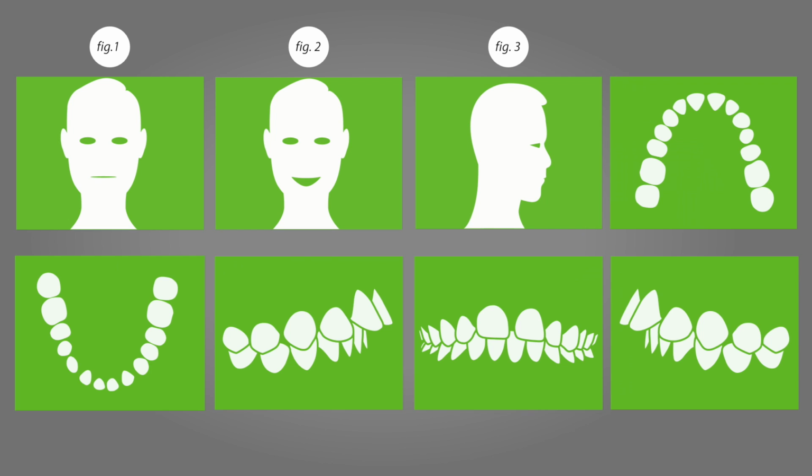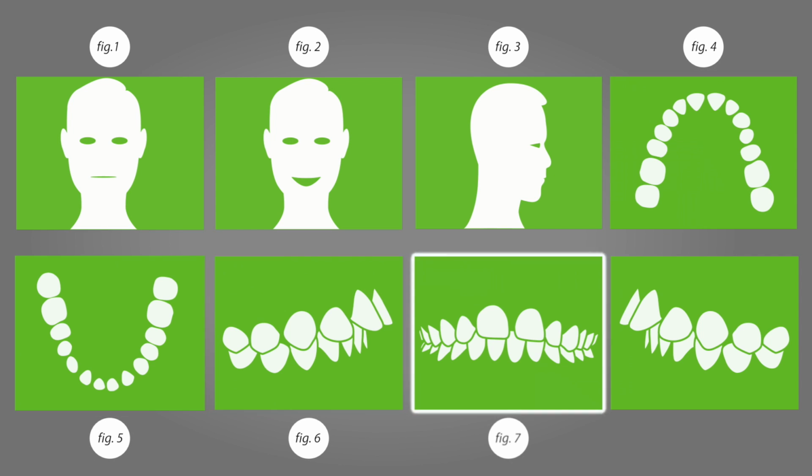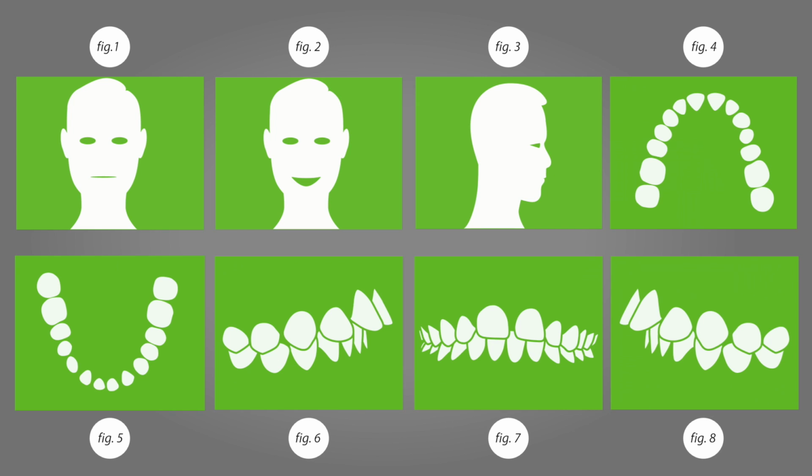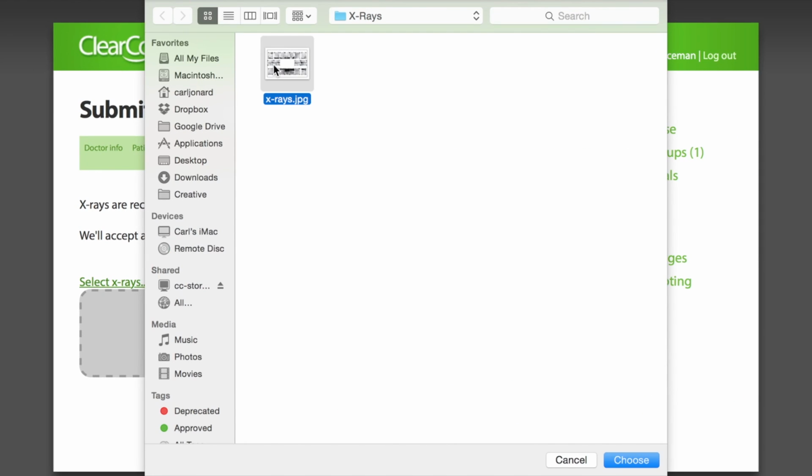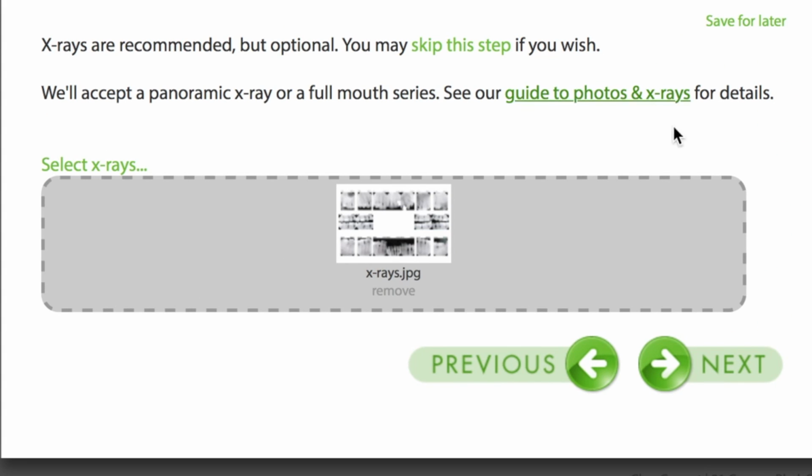You'll also need 5 close-up photos: occlusal views of the upper arch and the lower arch, and a clear view of the patient's right, front, and left. Make sure the posterior occlusion is clearly visible. In the next section, you can upload X-rays. X-rays are optional, but if you have them, we recommend that you upload them for more accurate treatment.